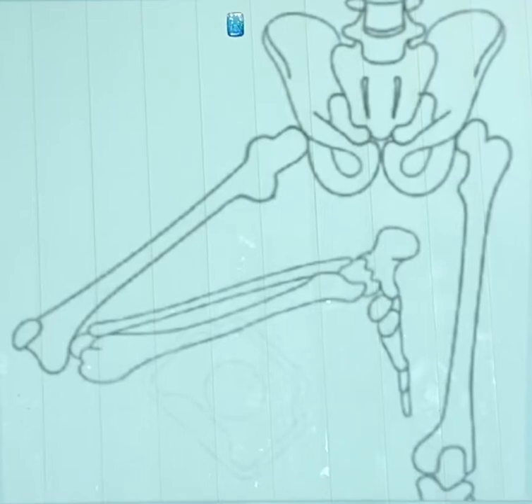I'm doing unilateral AP oblique, modified Cleaves method. The IR is 14 by 17. It's going to be crosswise. You are going to be using a grid. The SID is 40 inches.